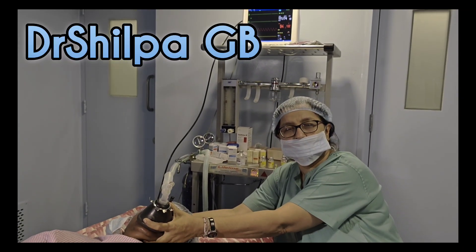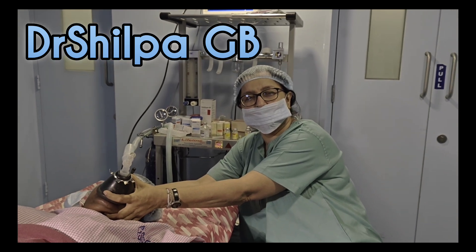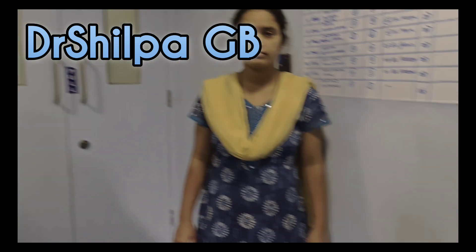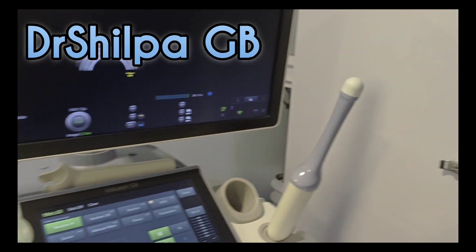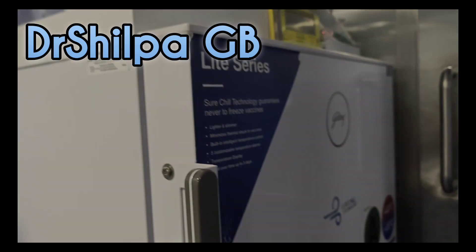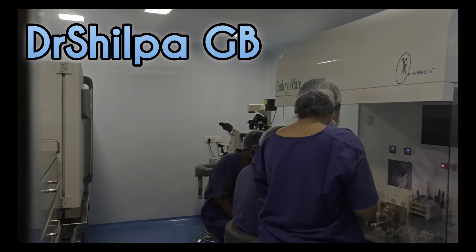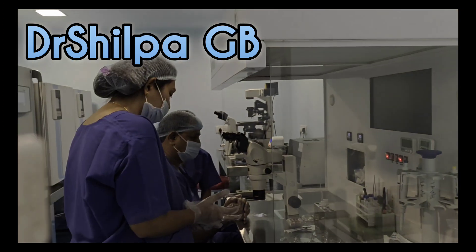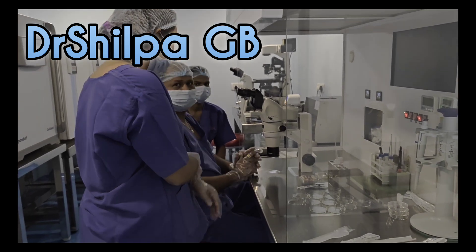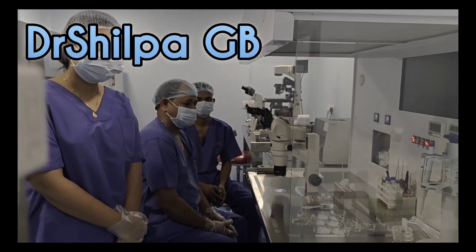This is a procedure of egg pickup or oocyte pickup. The anesthetist is here, the patient has been given short general anesthesia, and this is the ultrasound machine we will be using for the pickup. This is the medical refrigerator and this is the embryology room where you can see the embryologist getting ready to receive the oocytes after the procedure.